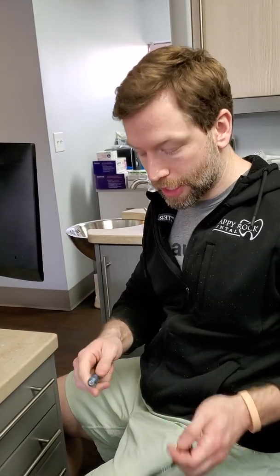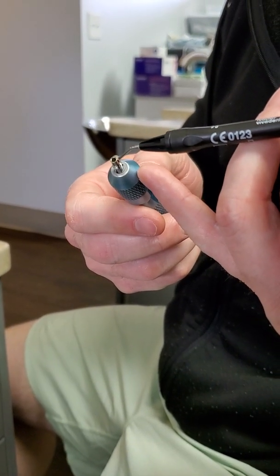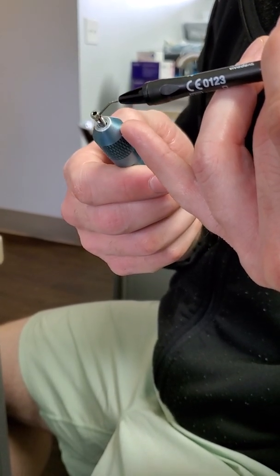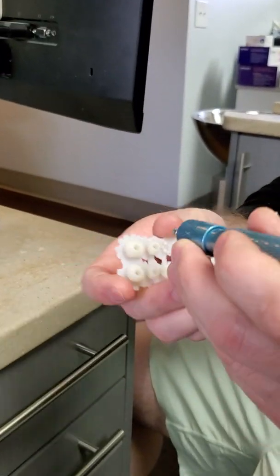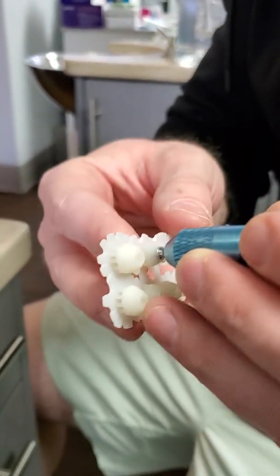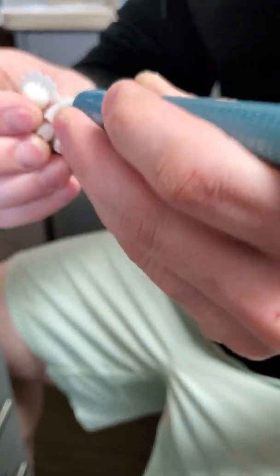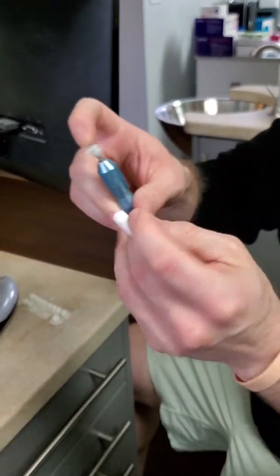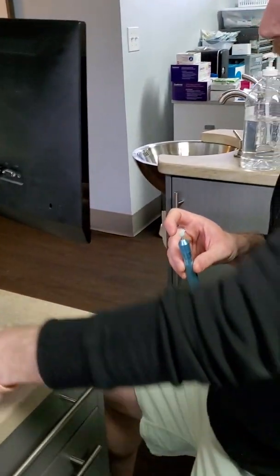So if you're in your procedure and you're ready to place one, or you do this ahead of time, simply express a little bit of flowable or cement right on the top rim. And then insert it — I'm going to do this lower premolar. Pop it off. I'll remove the rest of the supports after I get it on there. Take a cotton roll, wipe off the excess, and cure it.